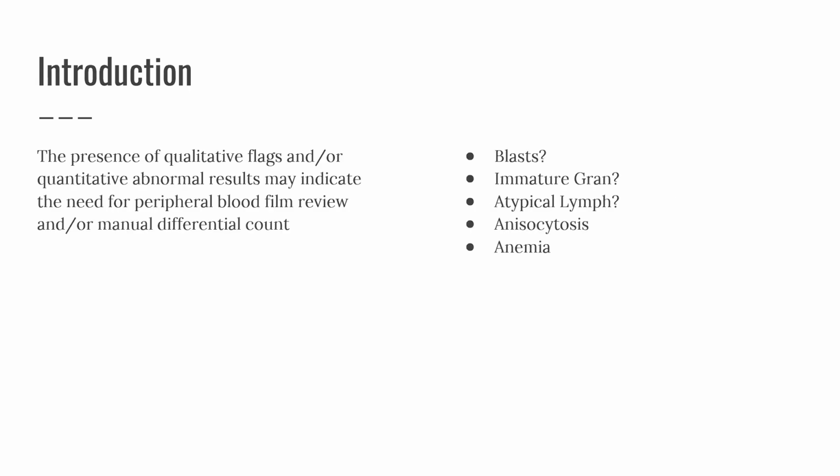For our hematological analyzers, the presence of qualitative flags and/or quantitative abnormal results may indicate the need for peripheral blood film review and/or manual differential counts.